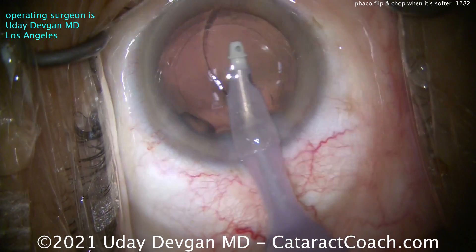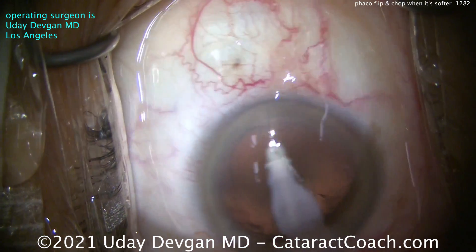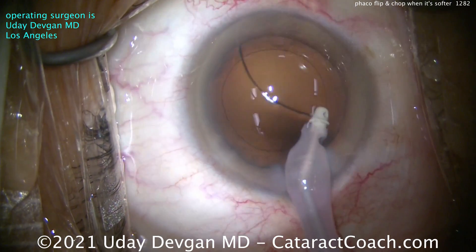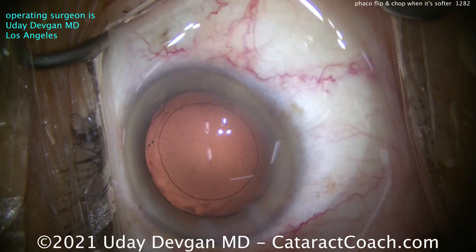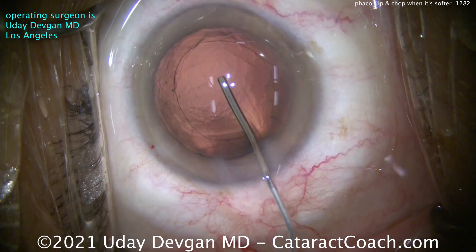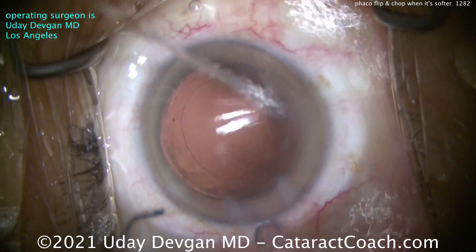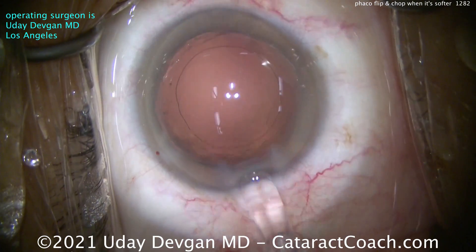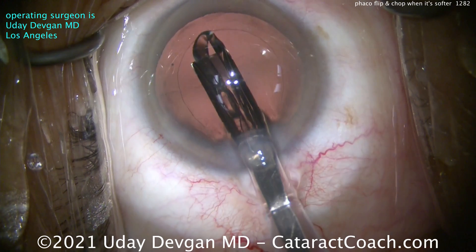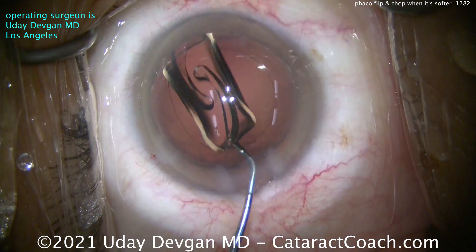Cleaning that up — there's a little bit of gunk in the viscoelastic, we'll clean that out too. We'll polish up the capsular rim, get this nice and shiny. There's a little eyelash or mucus strand on the cornea — we'll wash that off. Good looking rhexis. Now more cohesive viscoelastic going in to expand the capsular bag. Here comes the lens — looks like another single piece acrylic. Getting that delivered into the capsular bag, nice and easy. And there it is coming out, getting opened up and positioned. Now we can judge the size of the rhexis.